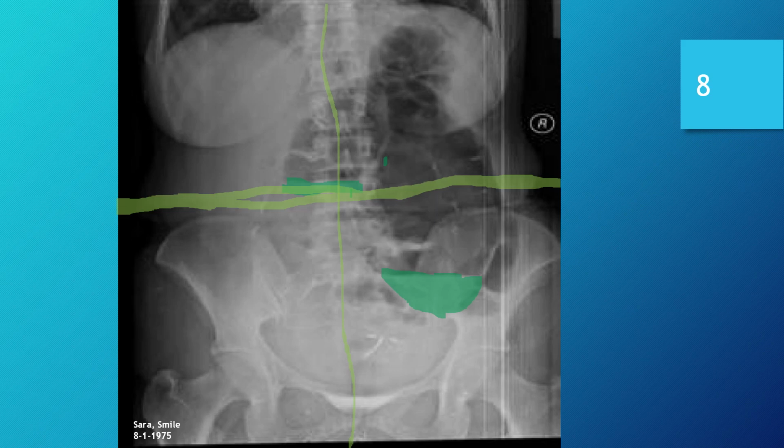This is going to be yes, but it definitely could have had some adjustments made that would have made it a much better image. Number one, with an upright abdomen, we do have to make sure that the entirety of the diaphragm is present, and of course the diaphragm runs right through that area there.